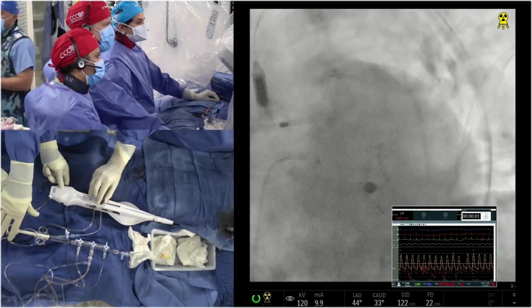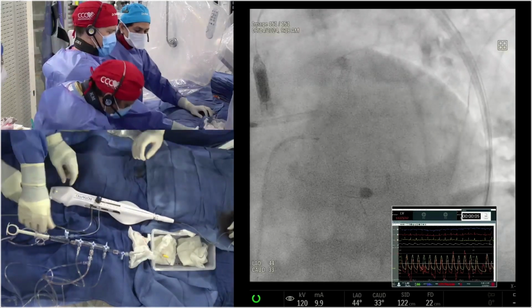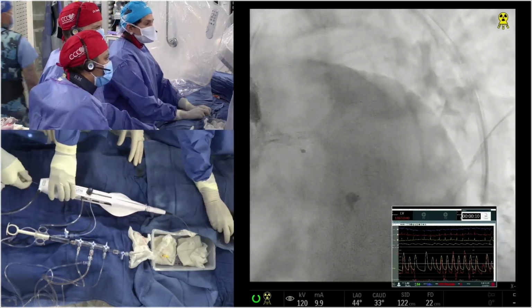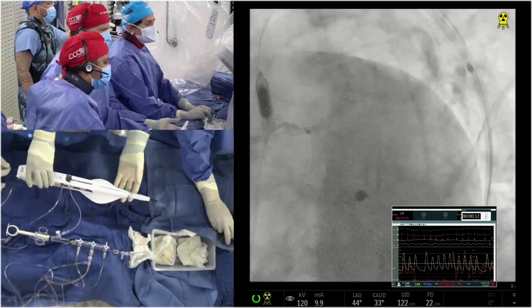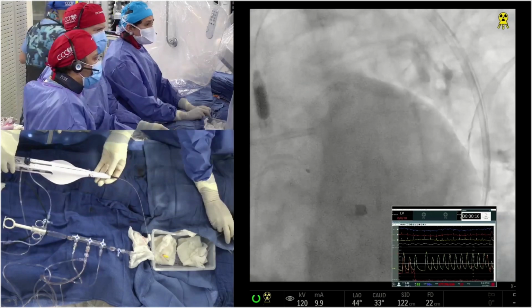But it looks like rotational atherectomy. Dr. Kinney, tell us, how does it feel to go through the lesion? And I saw that you stopped, sort of, the burr jumped a little bit. Do you want to tell us the size of the burr and what you did? Go back there. So the size of the burr, I picked 2.0.